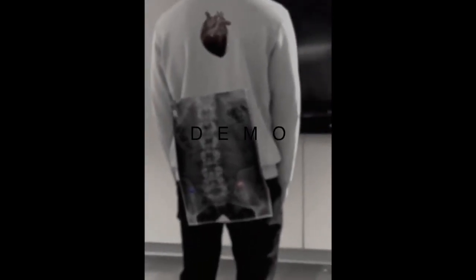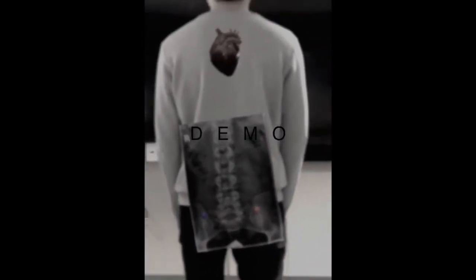Welcome to a demo of HUDTarM, an AR medical app. Today, we will showcase the features of this app that can help you visualize a human heart, display real-time heart rate and blood oxygen levels from a pulse oximeter, and display AR medical images over a person's back, such as an X-ray, using Apple's ARKit and automatic pose detection.